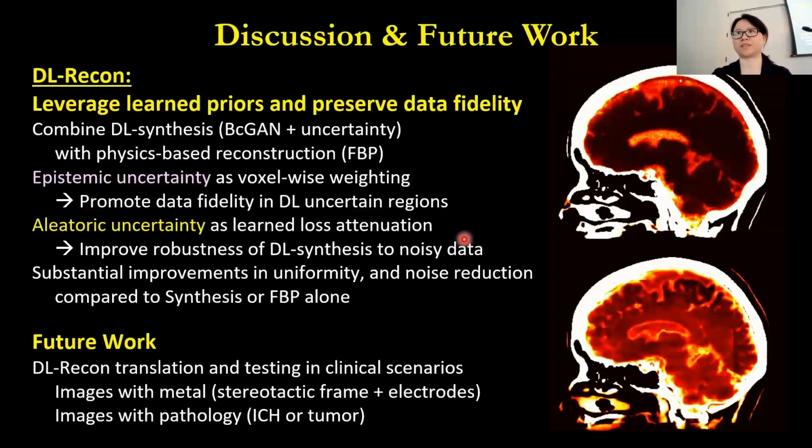Okay, thanks very much. Thank you. Very nice talk. I have two questions. The first is, I see your input to the network is uncorrected FBP. What's the motivation of using an uncorrected versus a corrected FBP?